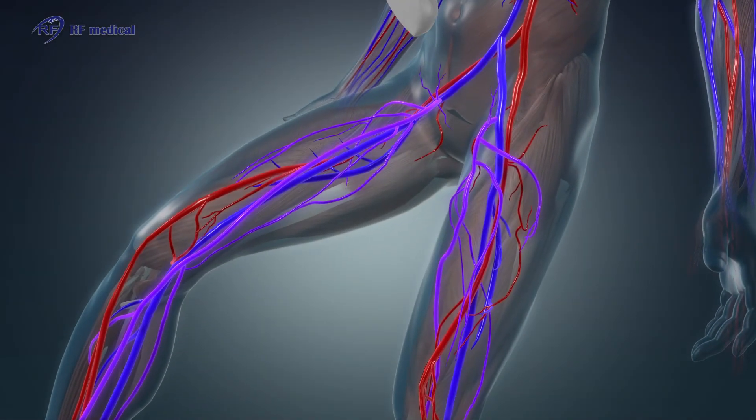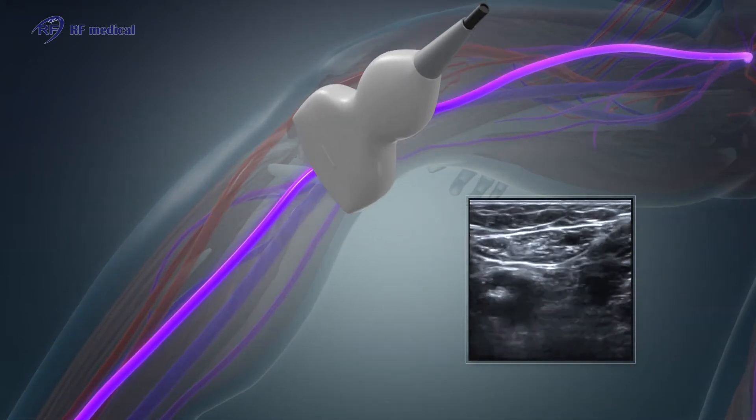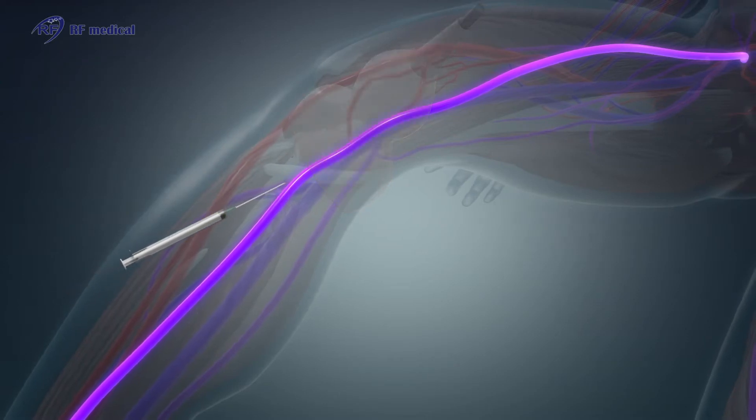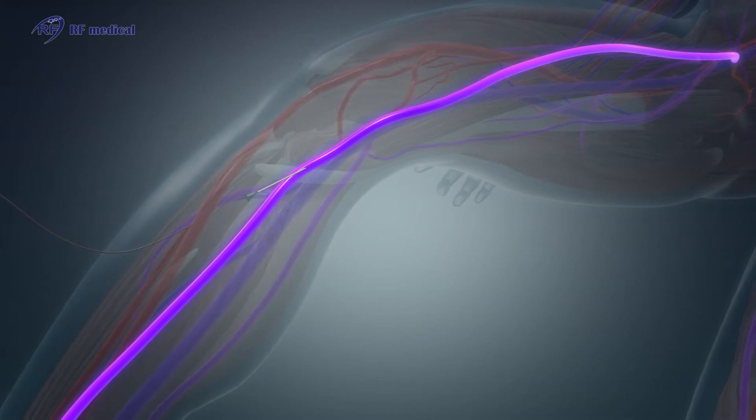The position of the great saphenous vein is confirmed by ultrasound examination from the saphenofemoral junction to below the knee. Under ultrasound guidance, needle puncture access is done percutaneously, and a guide wire is inserted into the vein.